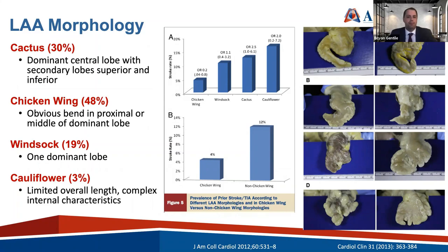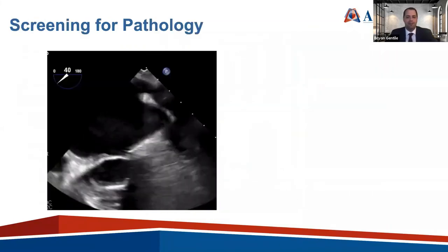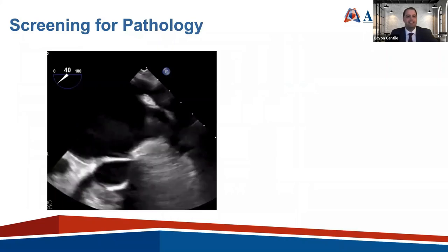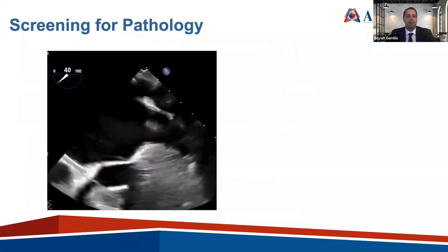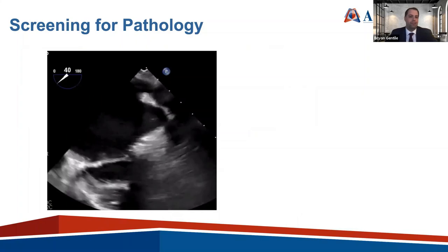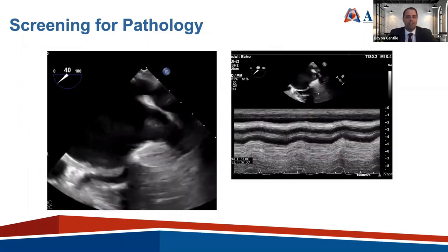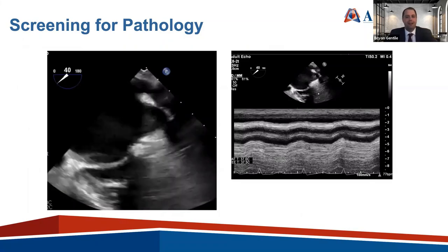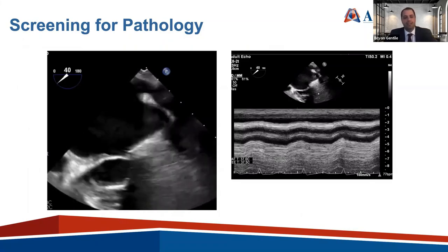Speaking of thromboembolism, the next step in approaching left atrial appendage occlusion is to screen for pathology. Here's an example of a reverberation artifact — a mirror image artifact. As an early attending, I would drop an M-mode through it and see that it follows the atrial ridge perfectly, making it unlikely to be thrombus.